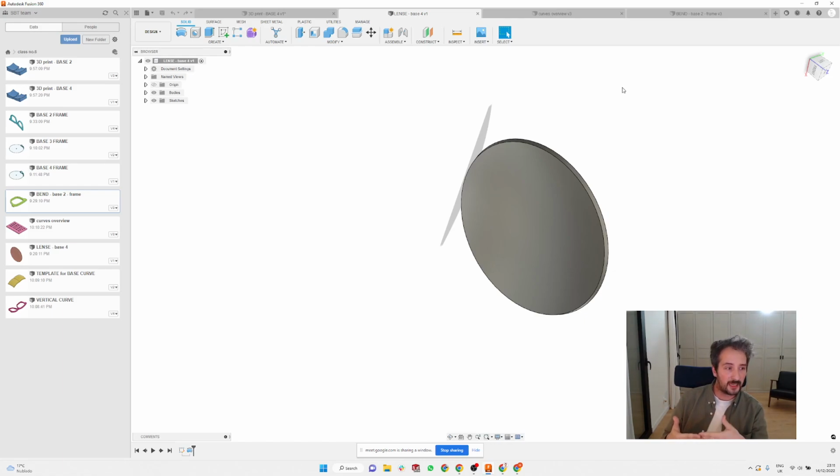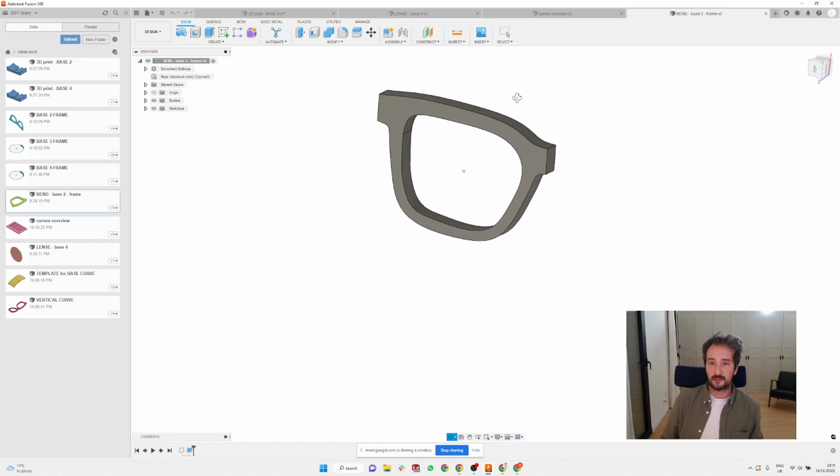So the base curve of the whole frame just means that you have two cylindric lenses, and then you make a hard angle between them and basically bend the whole frame in the middle, and that's going to give you the base curve. But on your left and right side, you're always following the lens curve. So I'm going to try to show you here.